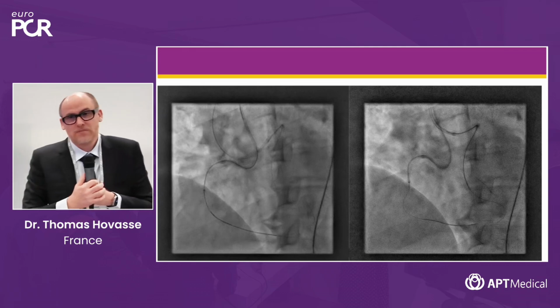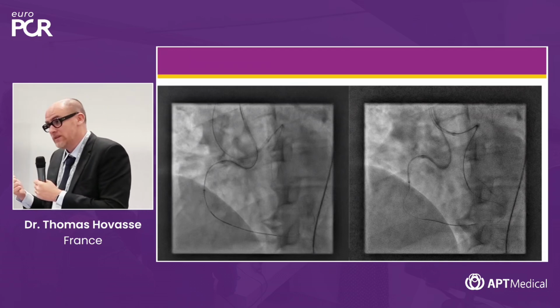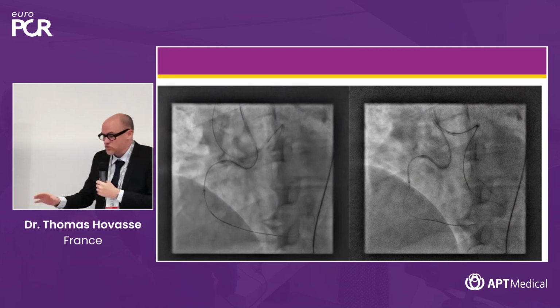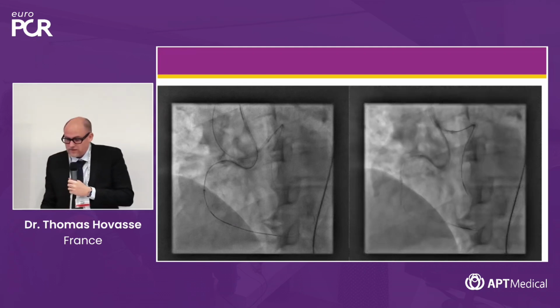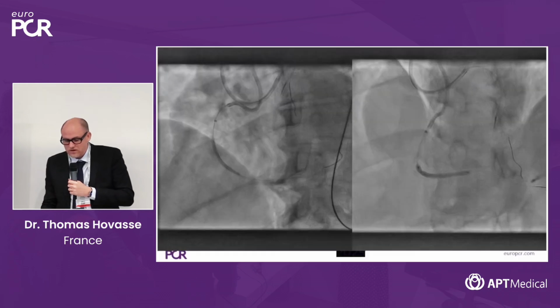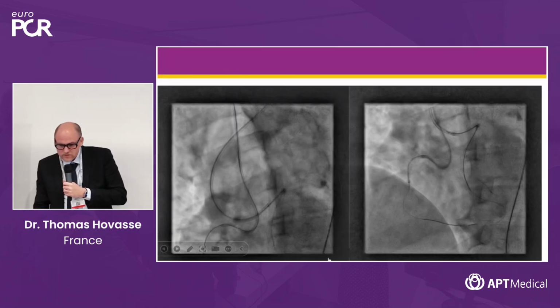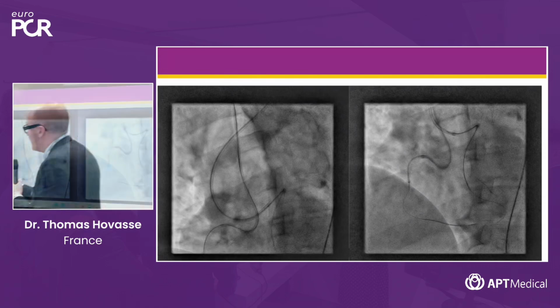do you know the tip-in technique or rendezvous technique? It's working very well. The only thing is you have for sure to take another microcatheter. So the principle is to bring a second microcatheter antegradely and to enter the antegrade microcatheter. I should have a video of the tip-in here.